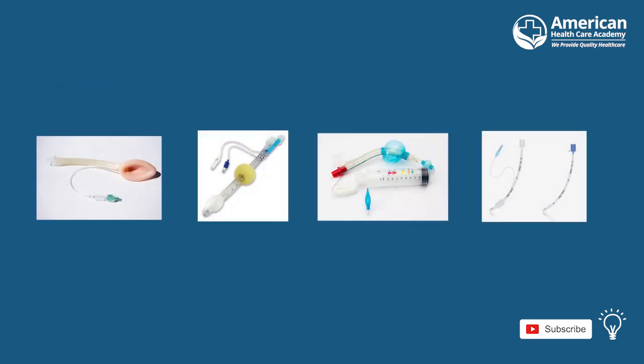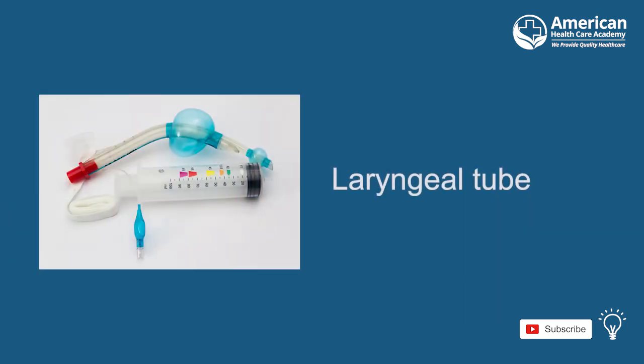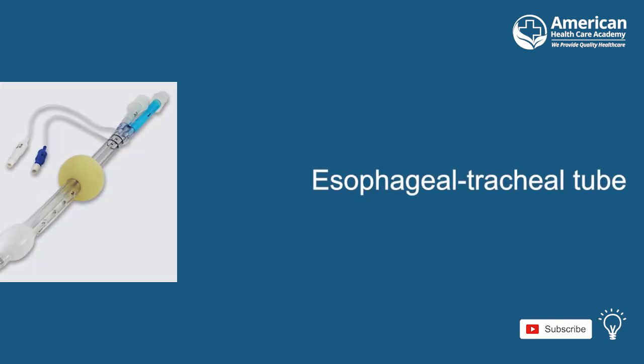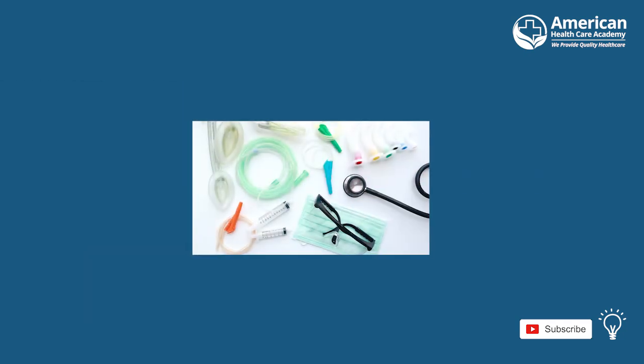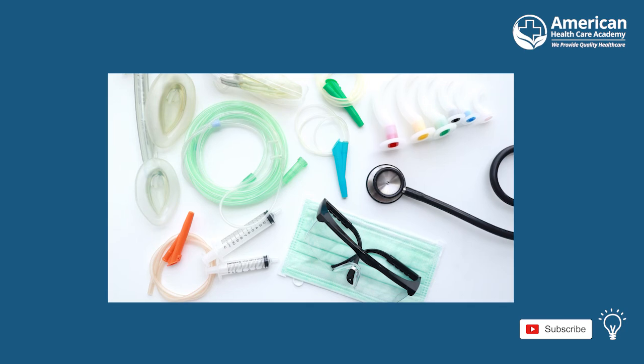In addition to basic airway tools, there are also advanced airway tools such as the laryngeal mask airway, laryngeal tube, esophageal tracheal tube, and endotracheal tube. The use of advanced airway tools is dependent on the training of the person practicing the technique.